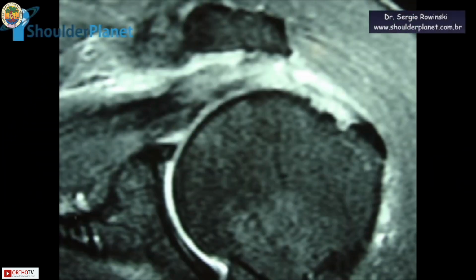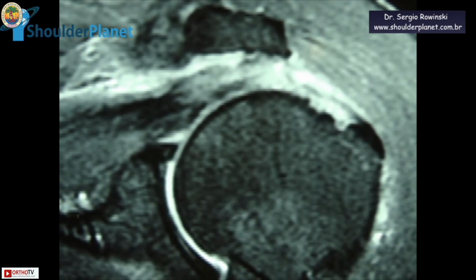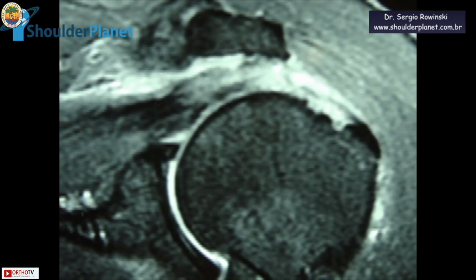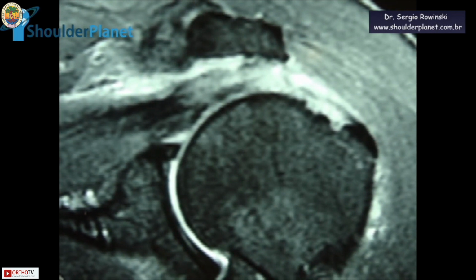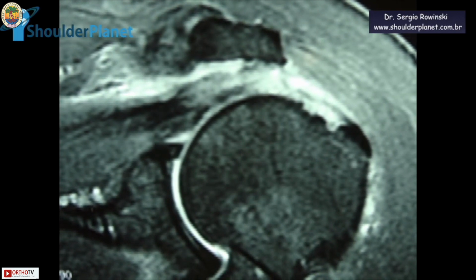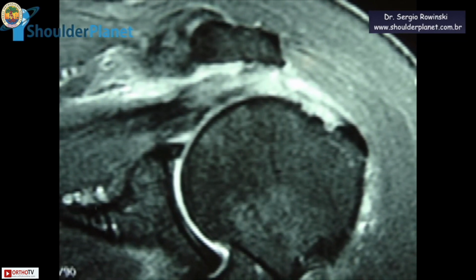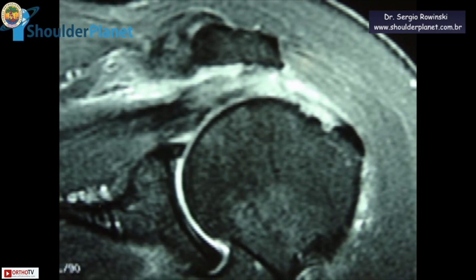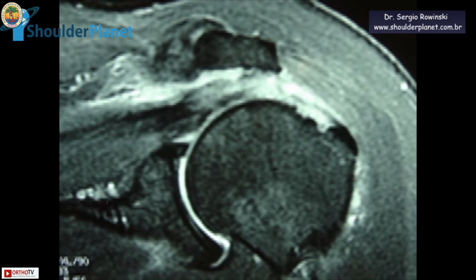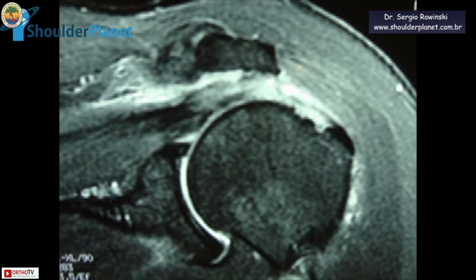Massive rotator cuff lesions are the most difficult kind of lesions to treat, and nowadays we know that there are quite different patterns of massive lesions in the shoulder. In this case, I am presenting a 64-year-old woman who had pain over her left shoulder for the last 3 years with very typical signs and symptoms of cuff pain.